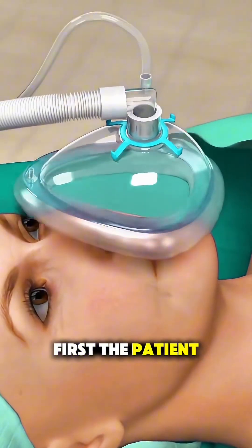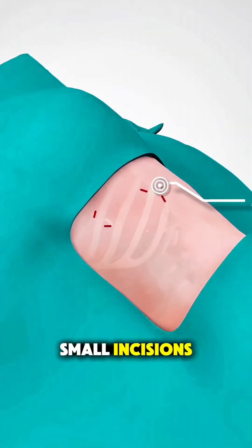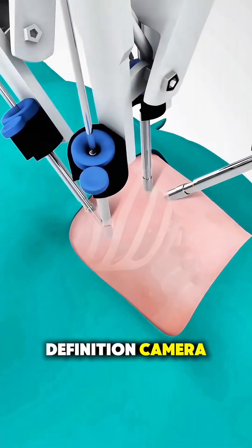First, the patient is placed under general anesthesia, so they're completely asleep and comfortable. The surgeon then makes a few small incisions, usually between the ribs, to create entry points for tiny robotic instruments and a high-definition camera.